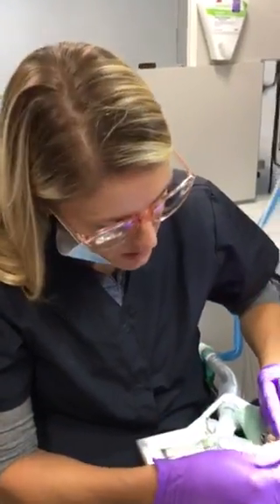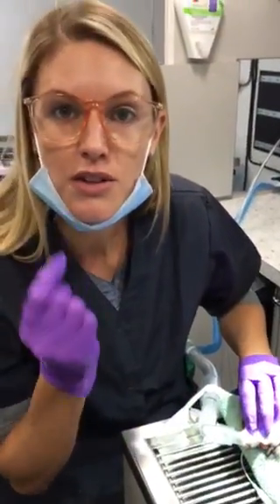The next step, which we won't show you for the sake of time, is that we will stitch the area where the tooth was closed. She's actually going to lose a couple more teeth, so I'm going to go ahead and extract across the row — again, all clean so we're not putting any infection up into the gums — and then I'm going to stitch across her gums. She's going to heal up in just a few days and she's going to feel so much better once these loose teeth are out. Thanks for visiting!